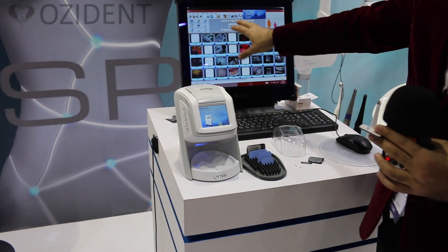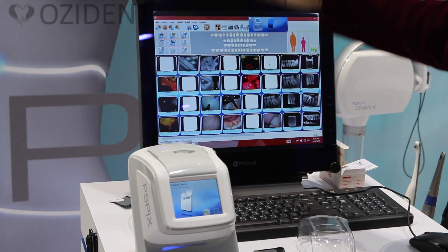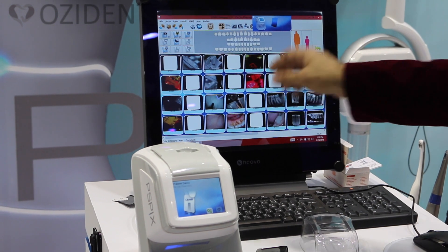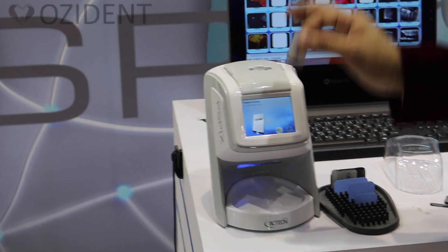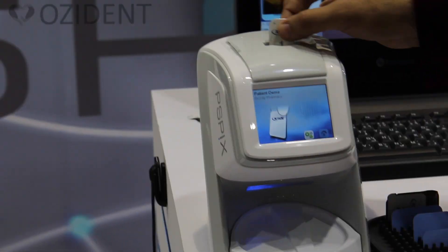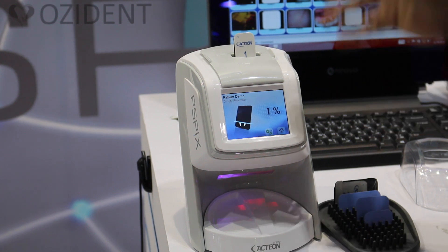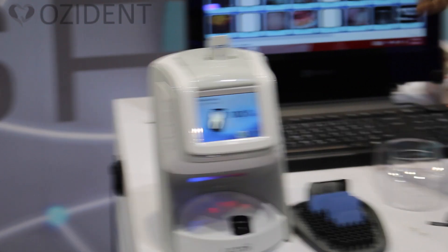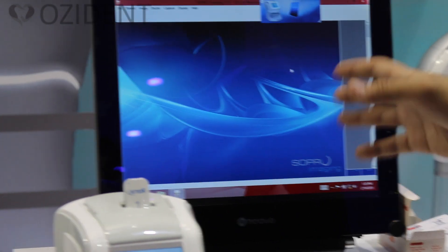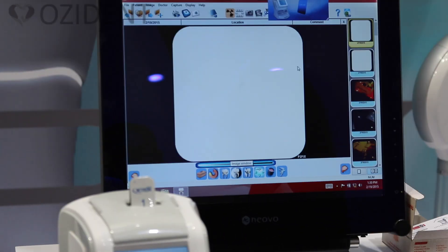Using the software, you choose the patient — because for every patient you can have a separate file. The machine simply asks you to insert the film. You leave the cover with the film inside; automatically the machine recognizes the film with a sensor, grabs it in, and does the scanning. On my computer it takes 5 to 6 seconds; on any other computer a maximum of 12 seconds.